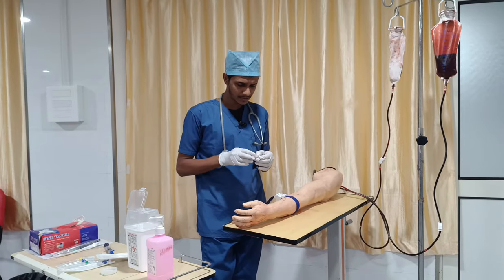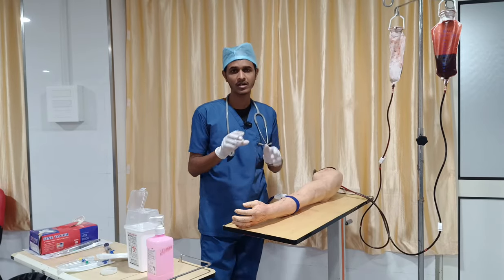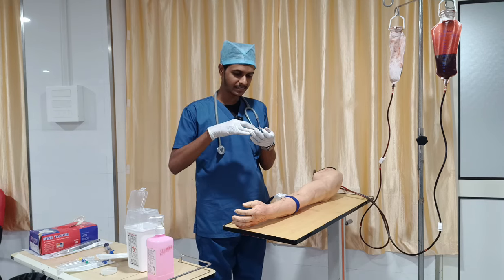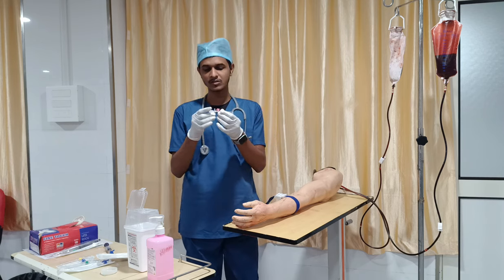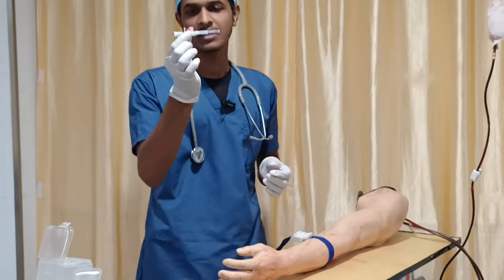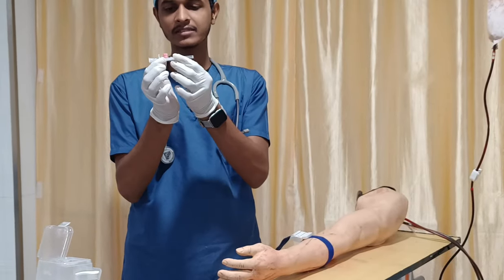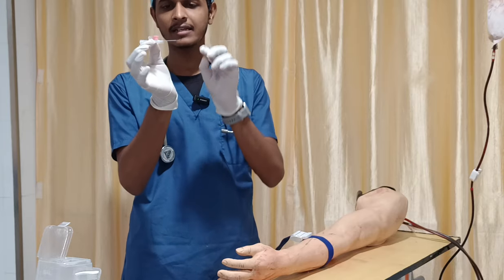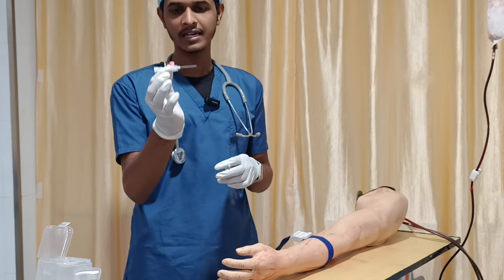So let it dry. You have to allow it to dry for 30 seconds to 1 minute. In the meantime, we'll see the parts of this cannula. I forgot to tell about these things. First, here we have this outer cap, which is a protective cap, and then here you can see the introducer.